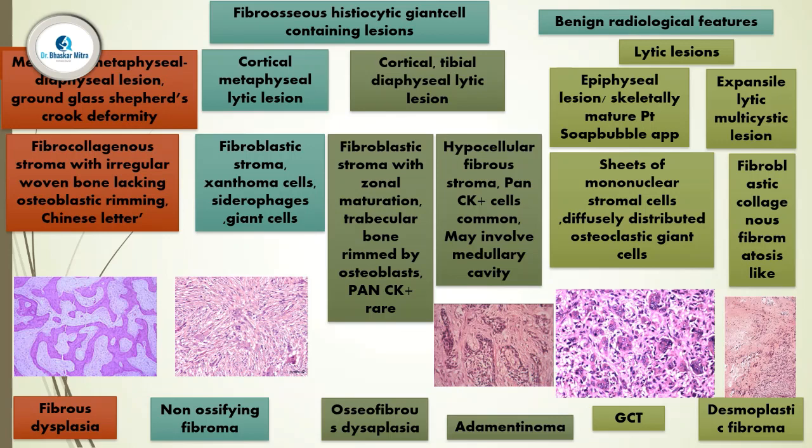Here we can see that regular, natural bone formation is hampered. It is more of a combination of haphazardly produced bone in a fibroblastic stroma. Here you can see the haphazard arrangement of these bones, which is usually not seen in well formed mature lamellar bone. So this is irregular fibrous formation, and this is fibrous dysplasia.